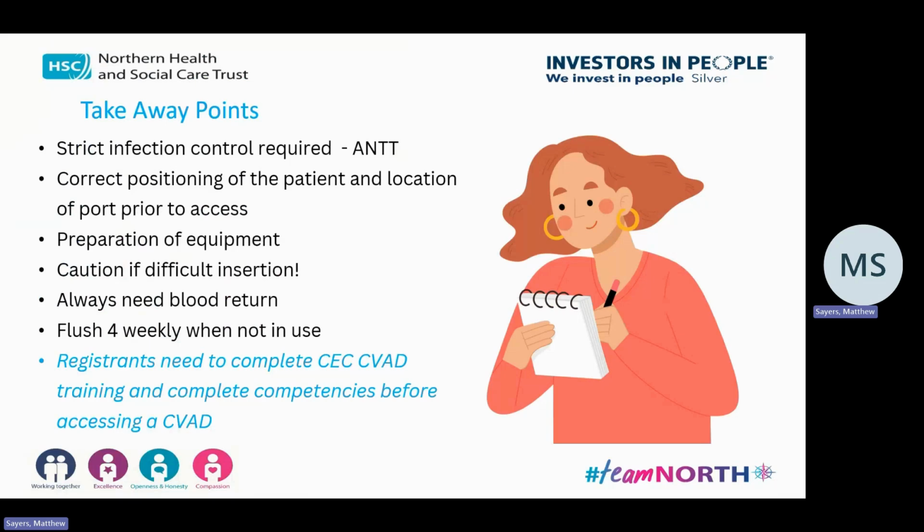If you need support from them, just ask them if they've got those competencies signed off. And with yourselves, you don't have to have those technical competencies, but common sense would tell you, do I feel competent to do it? And if you don't, my advice is always ask for someone to observe you, even for that first time, to give you confidence that what you're doing is correct.